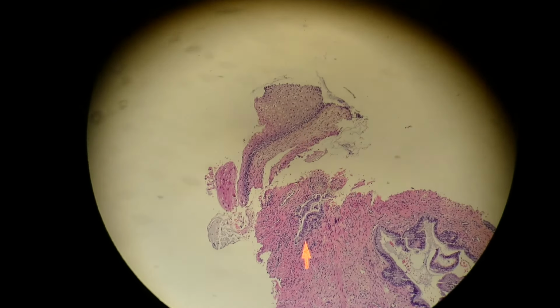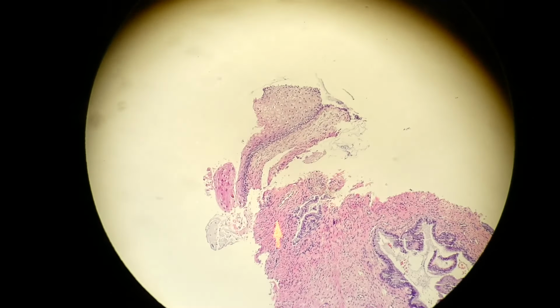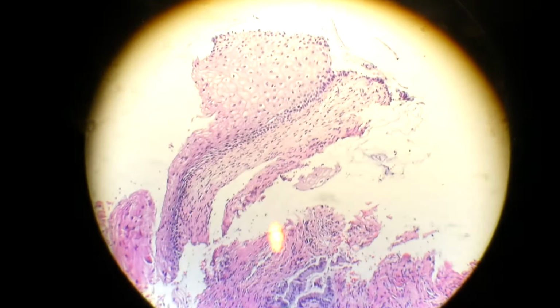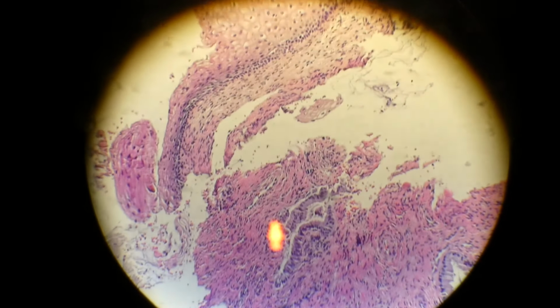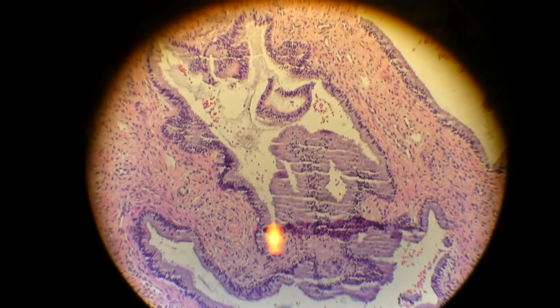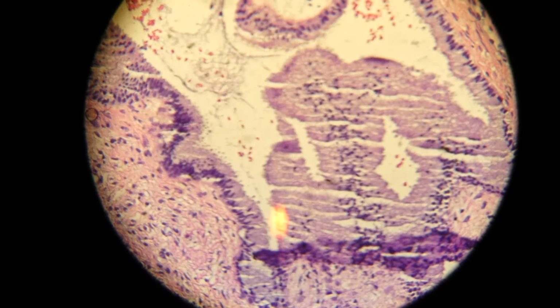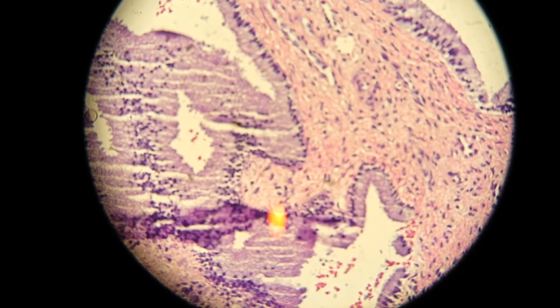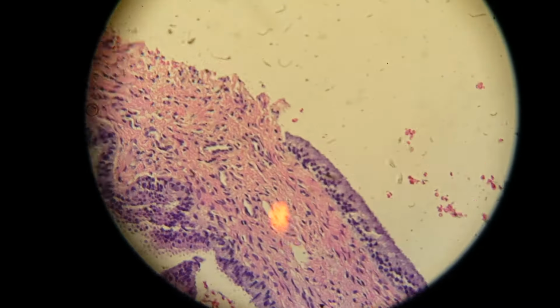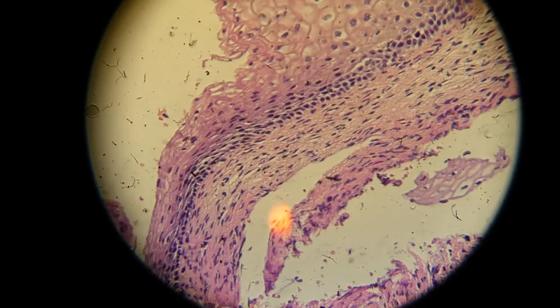And so when we see both squamous cells and endocervical cells, this is the transformation zone. And this is what will help us to identify any dysplastic or pre-malignant cells. And so here we can see the endocervical cells a little bit closer. And here are the squamous cells.